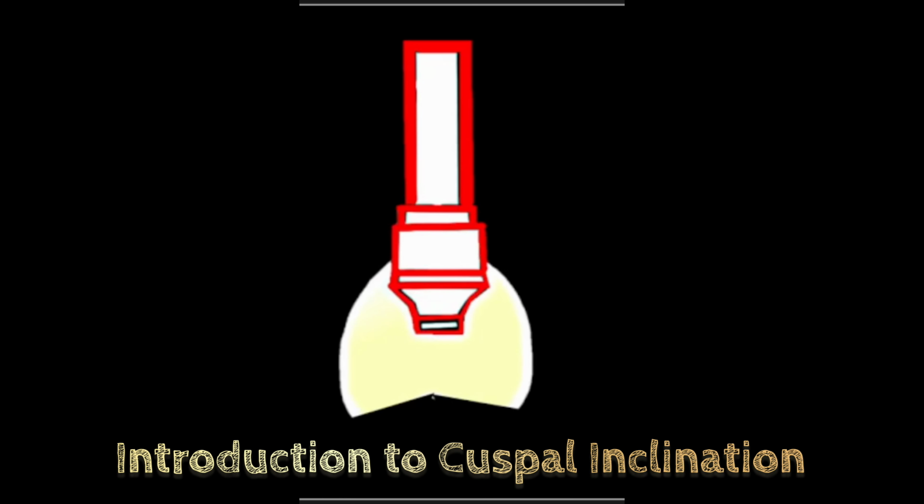Today we are looking at why flatter cusps are better in implant dentistry. It is important to remember that implants lack the periodontal ligament, which makes them less forgiving.